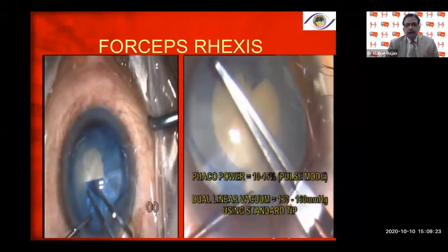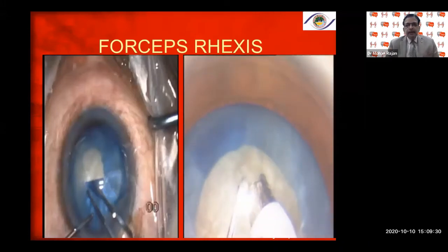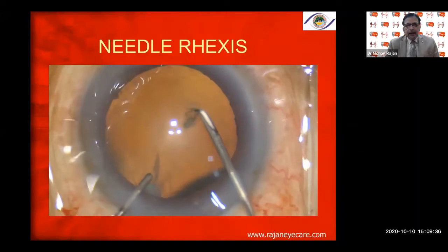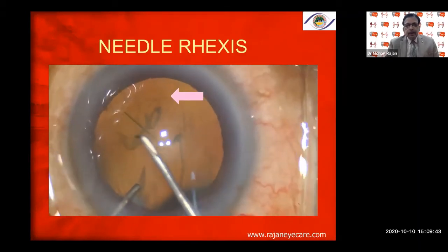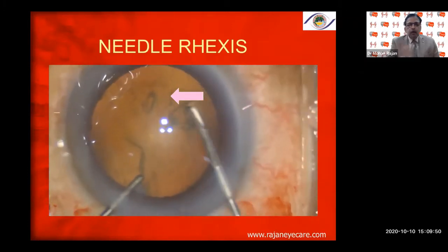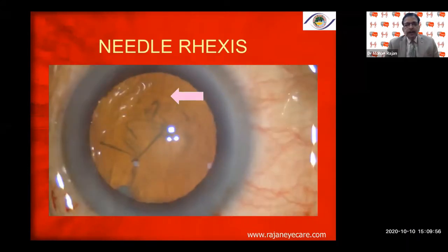Here I'm going to the right, creating what is called a guide flap, then going anti-clockwise — you can go either clockwise or anti-clockwise. Make sure the needle does not press the posterior lip of the incision; if you do, the viscoelastic will escape, the AC will shallow, and the capsule will extend to the periphery. Use a shearing technique and try to make a round, as centric as possible capsular rhexis.